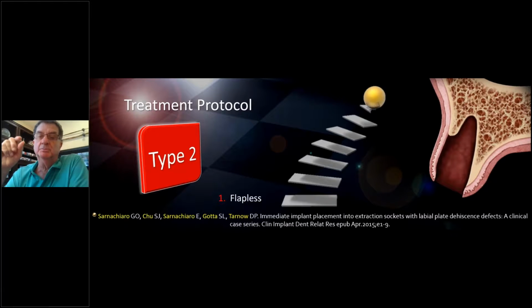So he's probably putting a piece of bone in, I assume. We'll talk about it during the discussion. But he's got to make a little hole, probably to suture in it, to bond it in. That's minor. It's not a full flap. I don't mind that, but it means extra work.